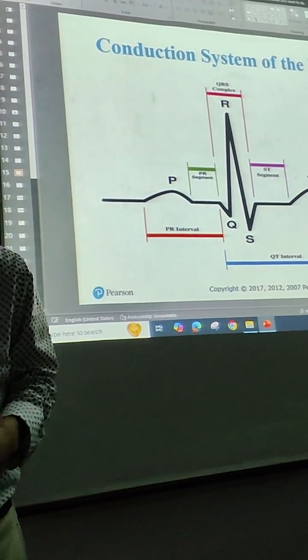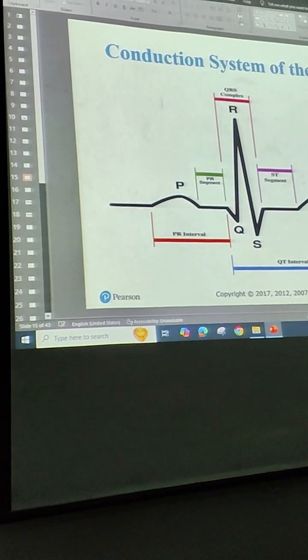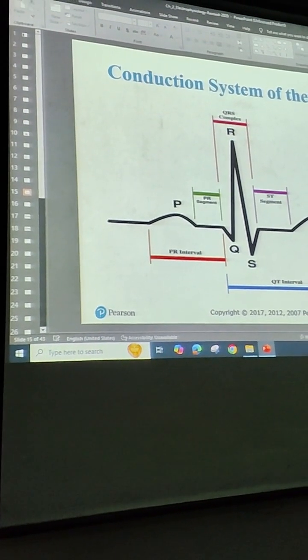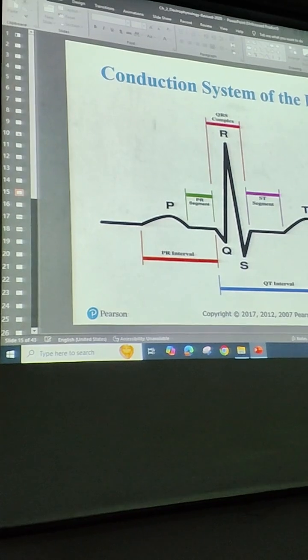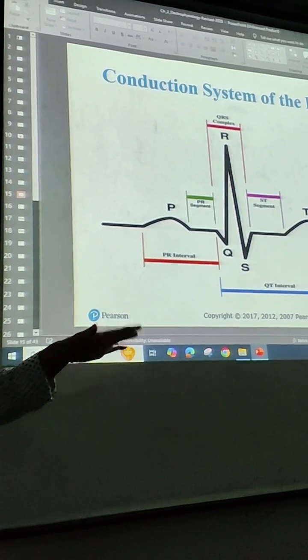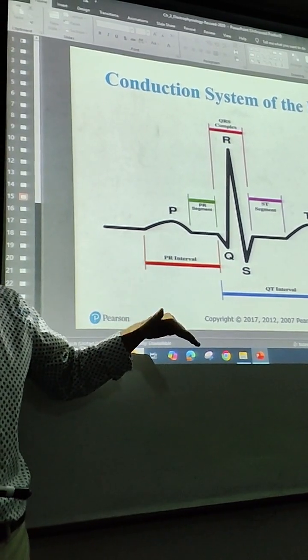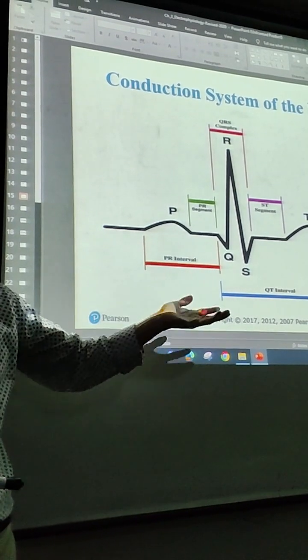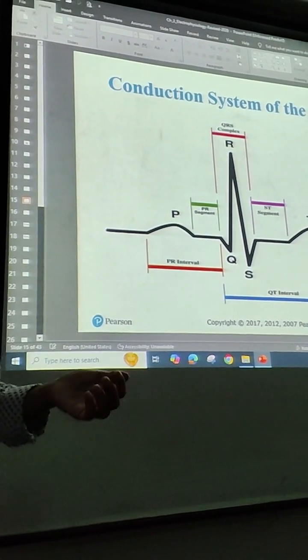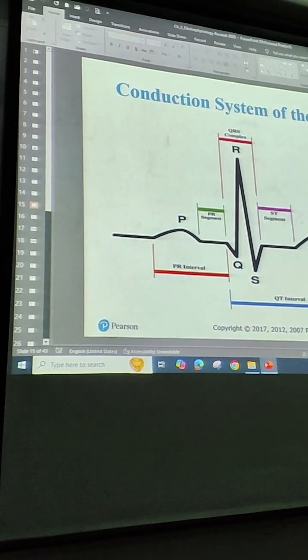And it's the time between the atrial contraction. The distance of the time. When we are measuring distance from where to where, then we talk about distance or time, right? But then when we see them together and there is no distance, you don't find anything in your answer, but it says, oh, it is the P wave plus the PR. Oh, yeah, that's the one.